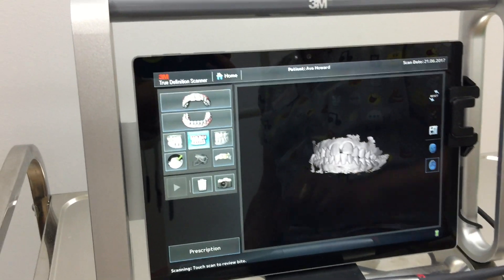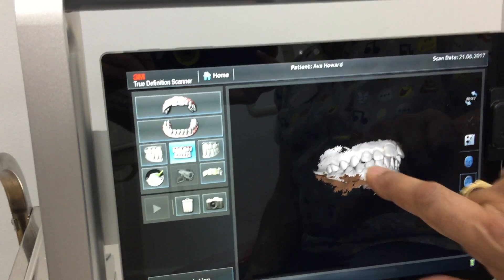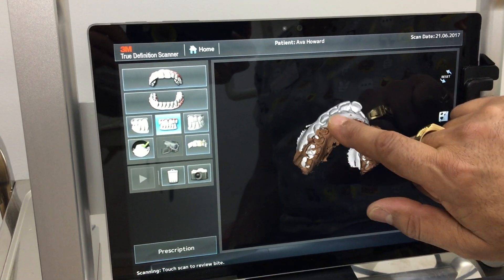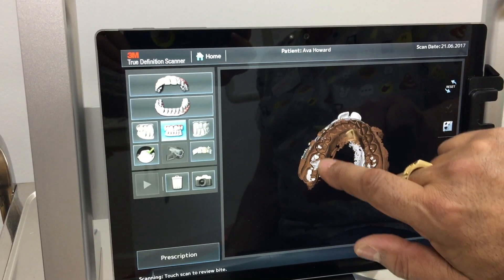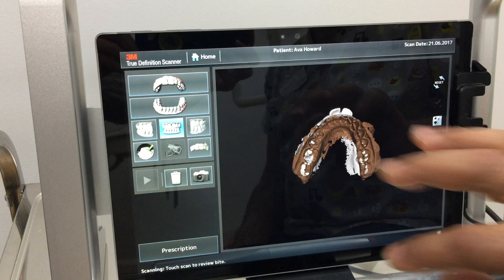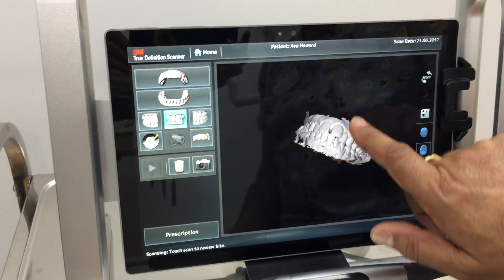Now if we actually look at the bite — we've taken a bite and you can see that's how the bite comes together. We can actually check if the teeth are touching. We look on the inside and there we see the silver of the top teeth, which means that bite is correct — she's actually contacting in that area.